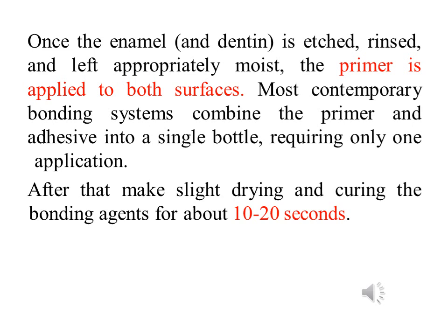After that, mix slightly drying and curing. Slightly drying in order to penetrate the adhesive and the primer into the dentinal network, or the microscopic holes in the dentin, so the primer and the adhesive will penetrate these holes and make a completely bonding with the adhesive system. After that, make slight drying and curing the bonding agents for about 10 to 20 seconds.